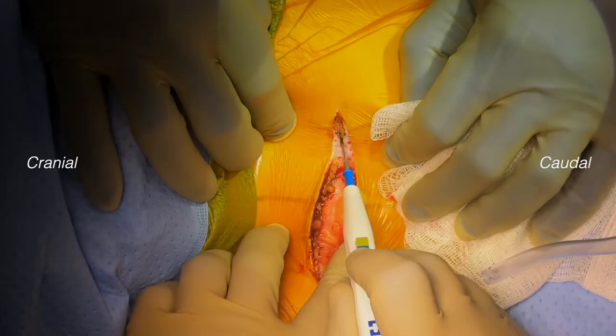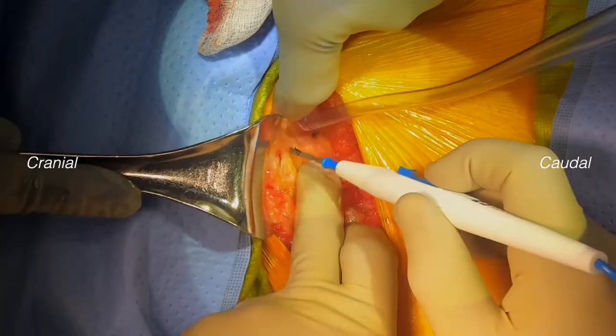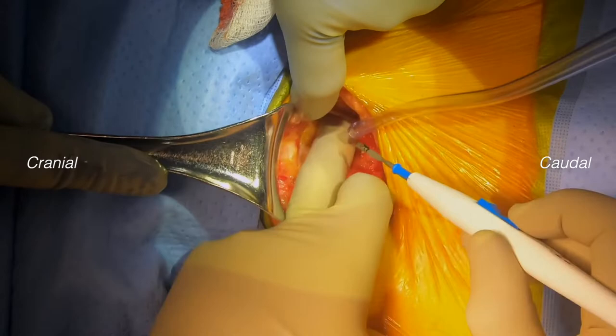We move through subcutaneous tissue with electrocautery and continue down to the level of the anterior rectus sheath. The anterior rectus sheath is visualized, and we further elevate the subcutaneous tissue on the left side, as well as midline where it is adherent.